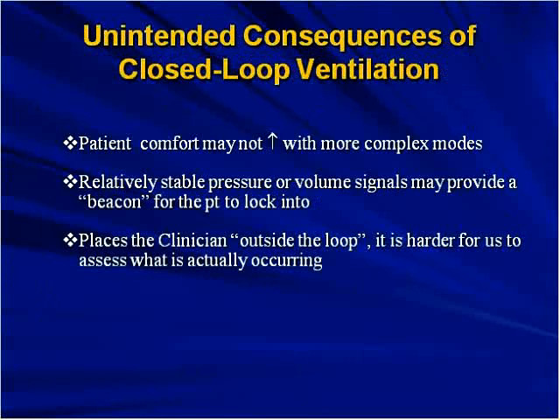So if you don't have a graphics package or a digital readout of peak flow rate, that's not going to be that helpful to you. But at least you can get an idea of what the tidal volume demand is. But thanks for asking that question. That was hugely important. I kind of glossed over it.